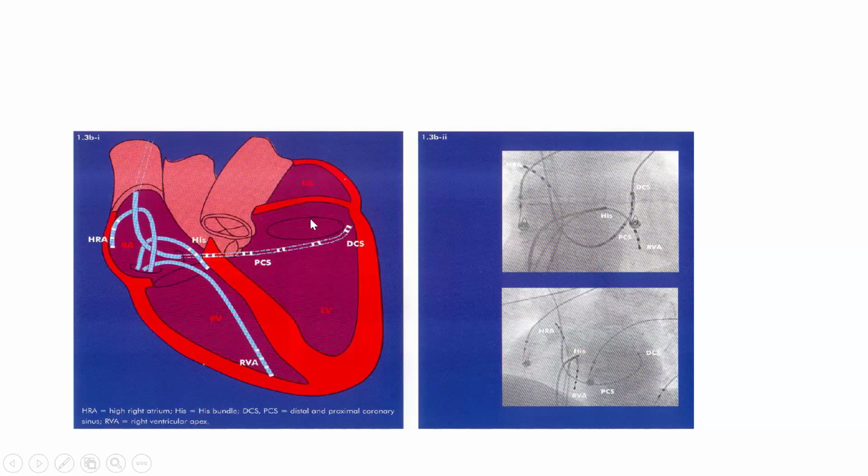So you can see why it's going to record both atrial activity and left ventricular activity. And at the proximal end, where it enters into the CS, that portion will be sensing what? Right atrial, lower right atrial activity.